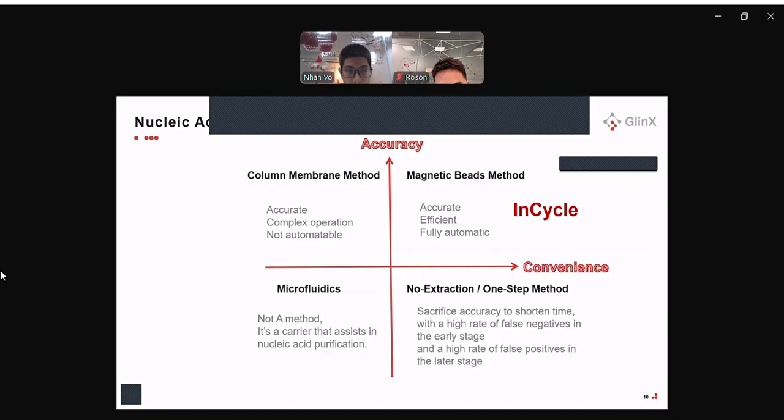And also, people will say, if I already spent a lot of money to conduct the PCR test, the accuracy must be really, really stable. Otherwise, before the in-clinic PCR machine got into the market, people normally sent the samples to the labs, right?